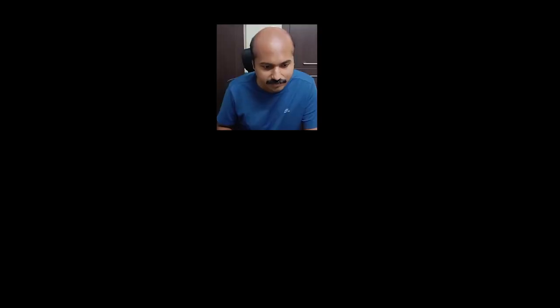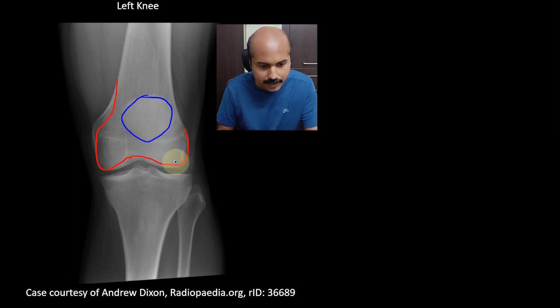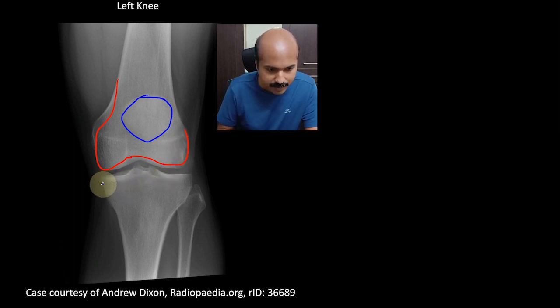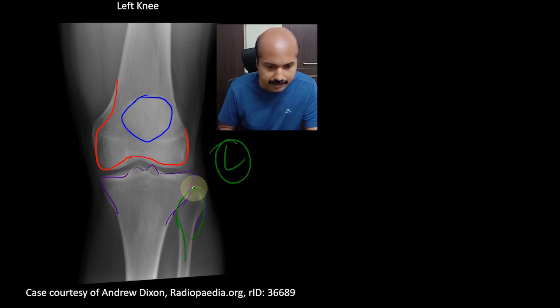Today we're going to learn something that is seen on an X-ray. We'll quickly take an X-ray of the knee — this is the left knee. You can see the lower end of the femur, the two femoral condyles, and the patella superimposed over it. Below you can see the tibia, the tibial plateau, the intercondylar region, and the upper end of the fibula. We can identify the lateral side and the medial side by the location of the fibula.